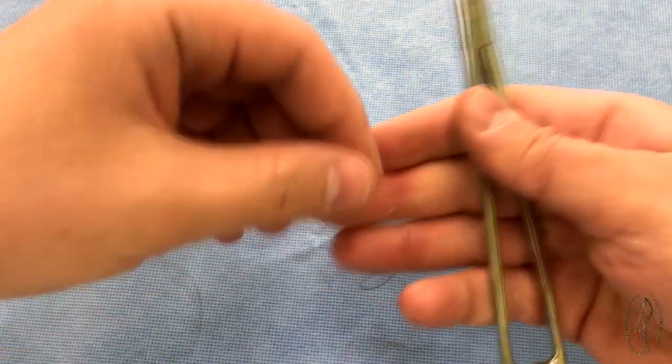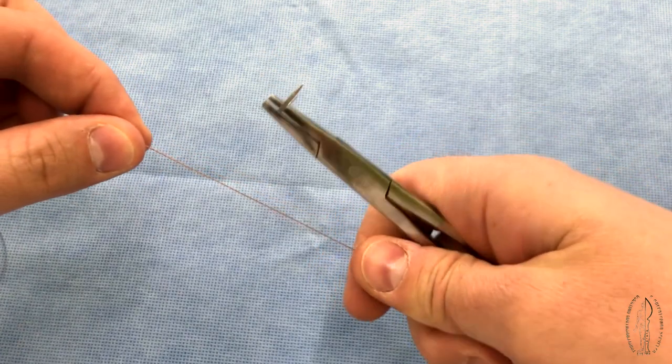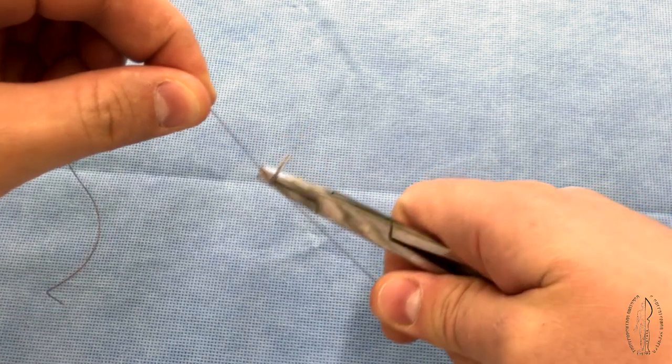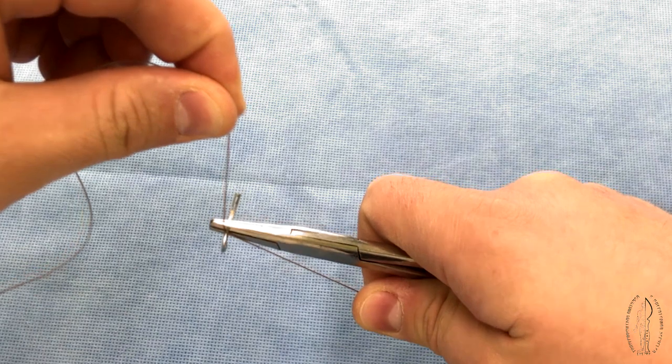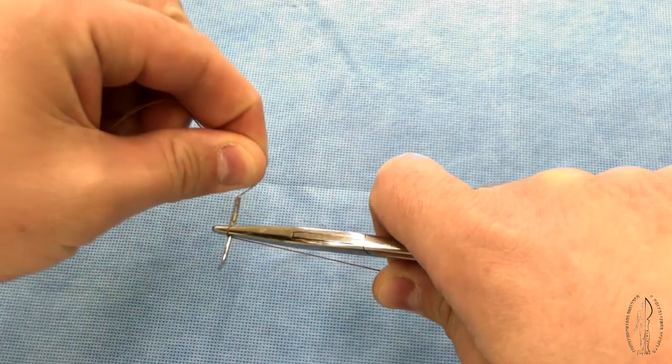Threading a needle. One end of the filament is fixed by fingers of the hand in which a needle holder is located. Another end is brought by the second hand to the end of the needle holder, pressed to it, and moved to the eye of the needle.